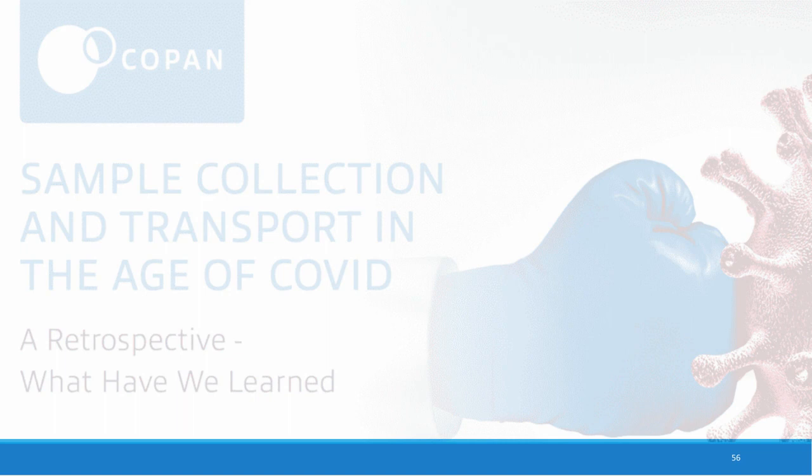Well, thank you for the question. This might have been asked before I went over this information, but in the presentation on slides 13 and 14, you can see that I've listed the absorption and the elution volumes of both the regular size swabs, which would be used for nasal, nares collections and also throat collections, and the mini-tipped swabs that would probably be more apt to be used for the nasopharyngeal collections that go back further into the nasal passages. So if you want to check back on slides 13 and 14, I have wrapped swabs as well as foam, as well as the flocked nylon fiber, in regular and mini tip, that have both the absorption and the release volumes for you.